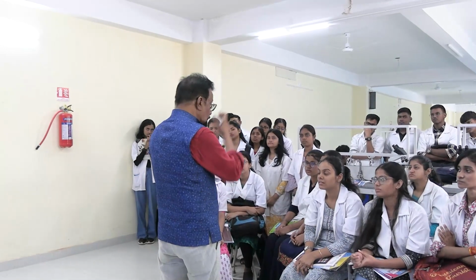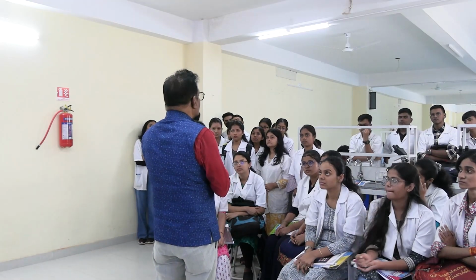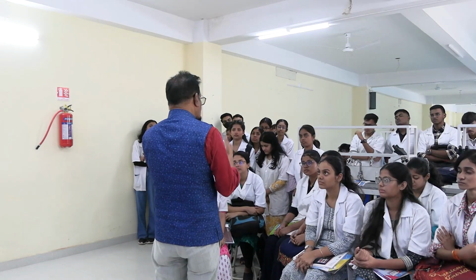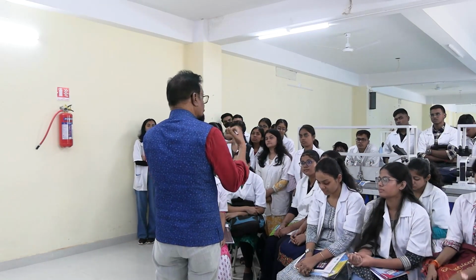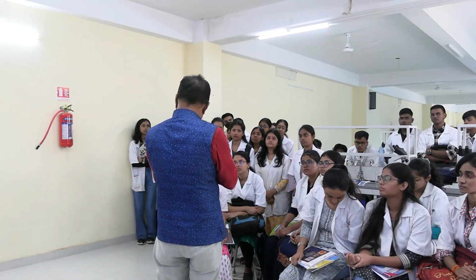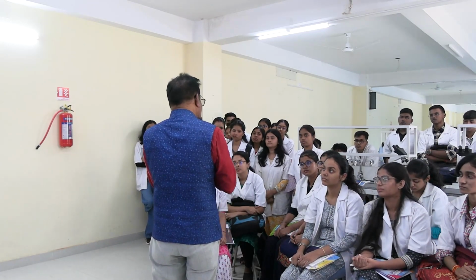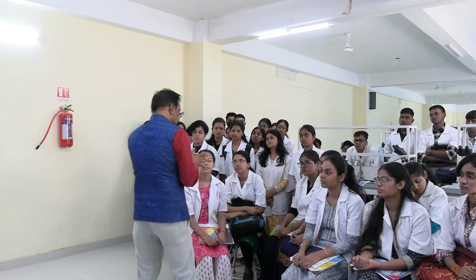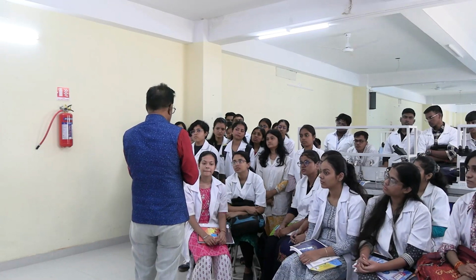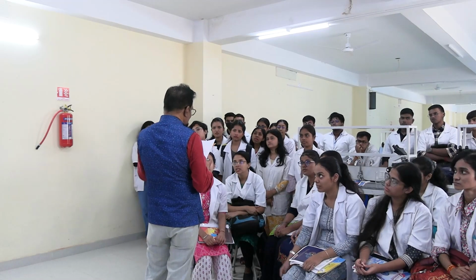If you count the WBCs this way, this way of counting WBCs is called the differential count. In different viral diseases, tuberculosis, cancer, the picture of the differential count, or these numbers, will vary. So with that you can confirm, suggest or diagnose that yes, this sort of infection, viral or bacterial infection, is there. So this is the purpose of doing a blood smear.